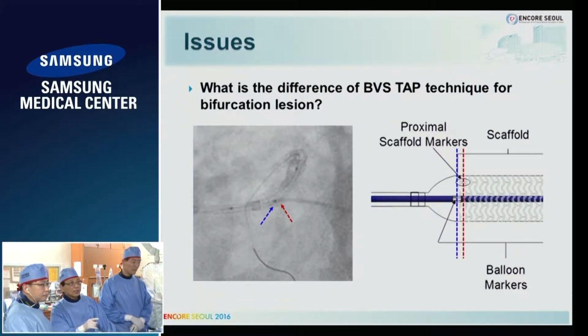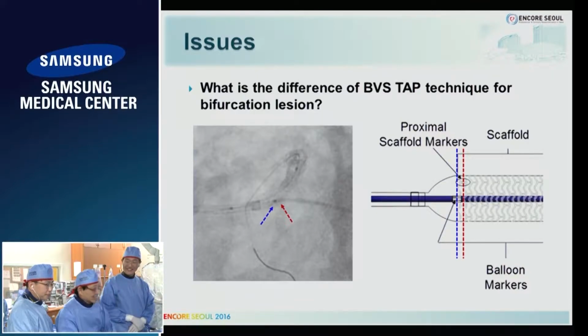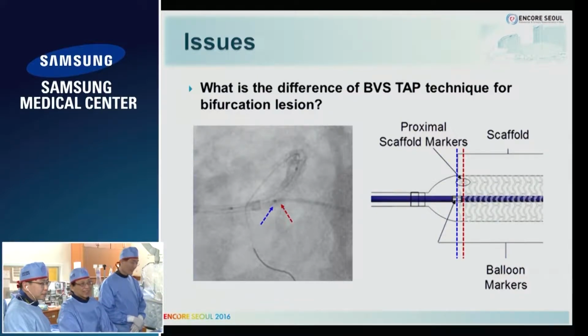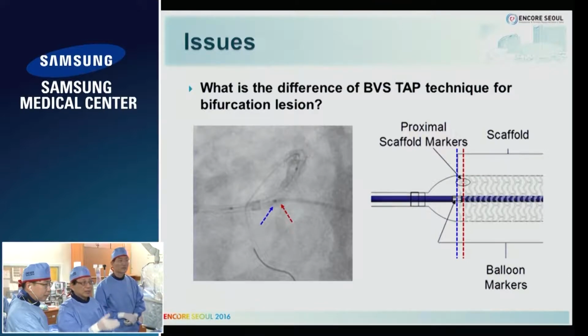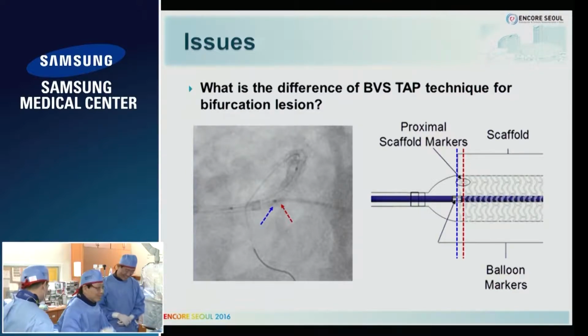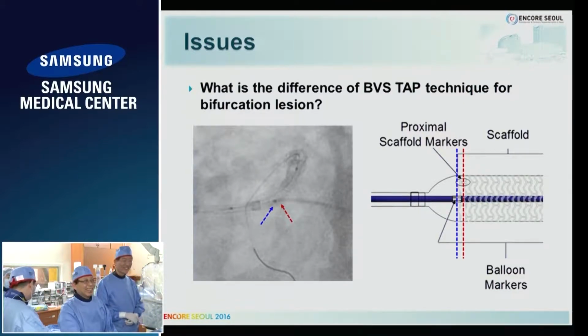Do you see the slides? This is very important slides. You see the slides of Dr. Gwon? Yeah, sure. Okay. They're seeing. We can see. Okay, so what other issues would you like to raise from the panels? I'd like to hear. I think the only thing is, we can use stent boost to get better visualization of the markers. Stent boost or stent fit. You don't have a stent boost. Oh, yeah. Sorry.